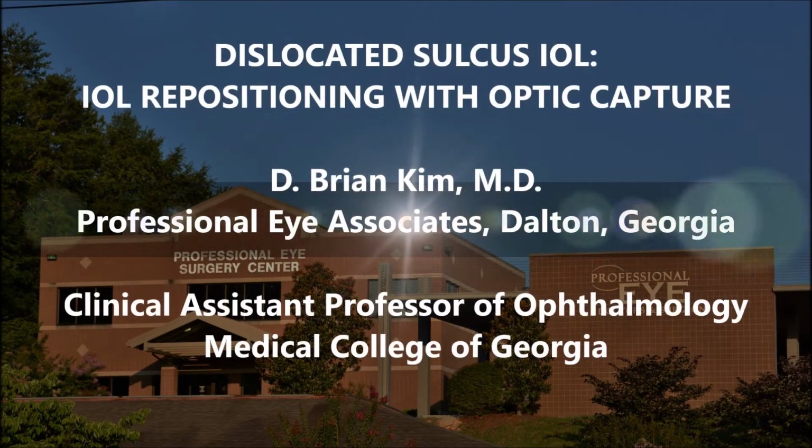I want to share with you this case of a patient who was referred to me. Her other eye has had a retinal detachment, and essentially this is her good eye. And she had a lens dislocation, which was then exchanged, was placed into sulcus, but was still dislocated afterward. And so the patient's referred to me to see if there's anything else that can be done. Every IOL dislocation case poses different challenges, and so we'll see what this case shows us here.